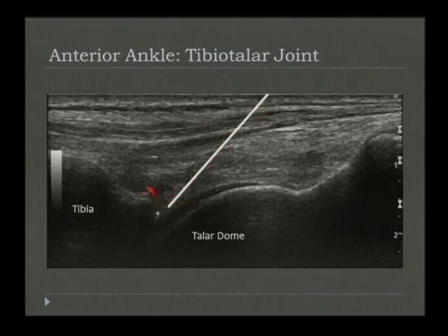You also want to look to make sure that there aren't large osteophytes off of the anterior aspect of the tibia or off of the talar dome. That would be a sign of impingement. Again, you can flex, dorsiflex and plantar flex the ankle to see if those osseous structures are abutting, and if the patient has signs of anterior impingement, typically have pain. Again, go back to that deep peroneal nerve, make sure it doesn't have fibrosis around it. Often we'll give them an injection in that area.